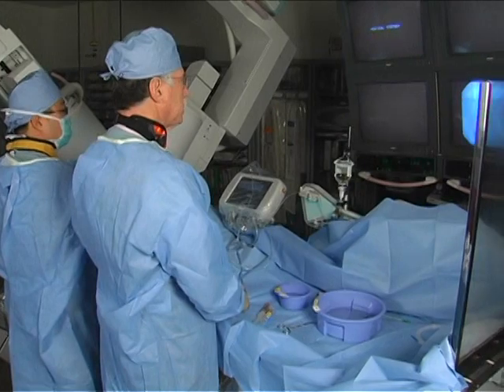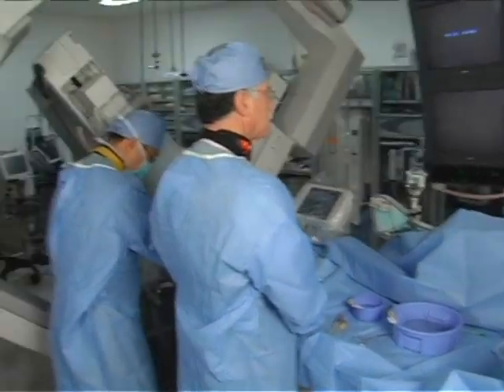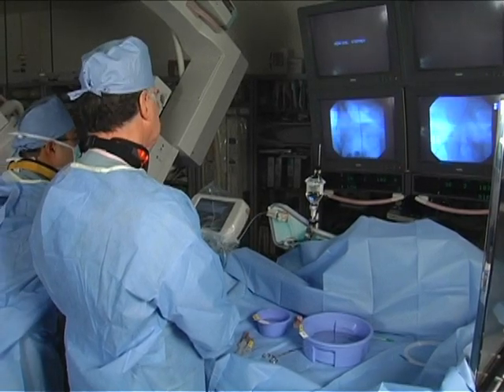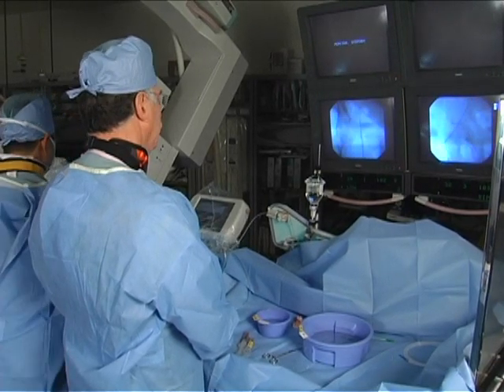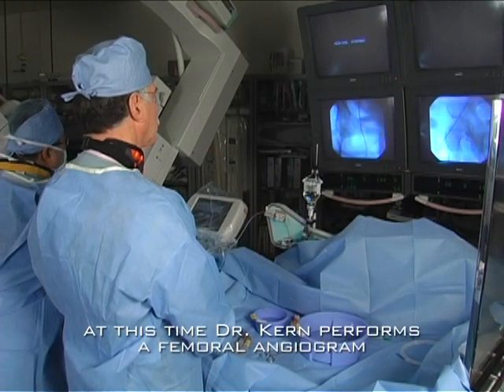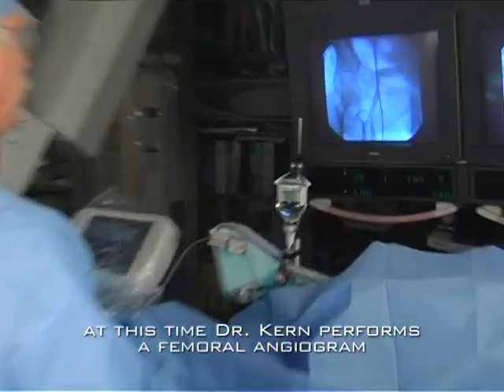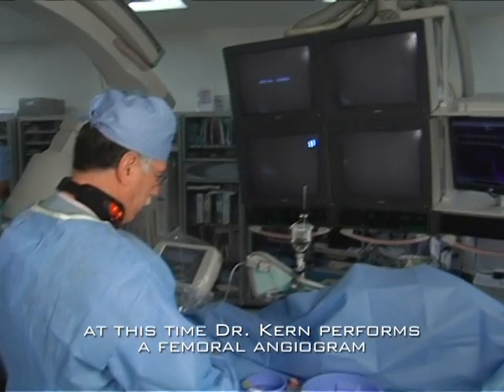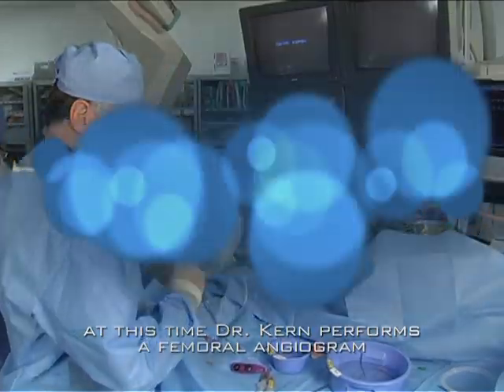Okay, so let's take a look. Come down a little, Will. You have to bring the catheter down a little. Okay, good. Cine? Perfect. Stick. Who did that? Okay, good. Flush that for me. Okay, we're going to take a picture of the ventricle next.